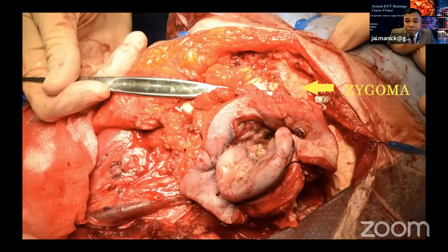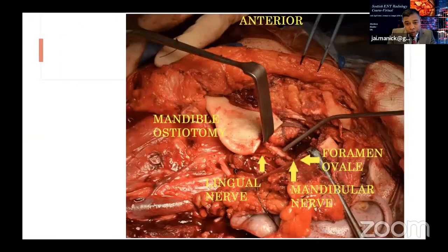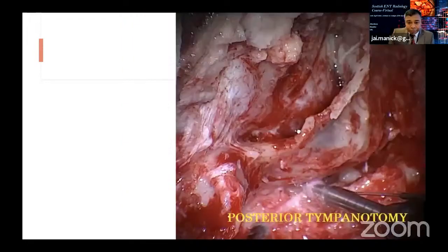And in the front, we're trying to divide the zygoma, and we are approaching the TMJ joint that has been disconnected. Underneath, you see the lingual nerve and also the mandibular nerve, then the foramen ovale. In the preoperative setup, the foramen ovale was involved, going intracranial, that's one of the contraindications for the operation. So in this case, it was not involved. That's why this patient underwent radical surgery.